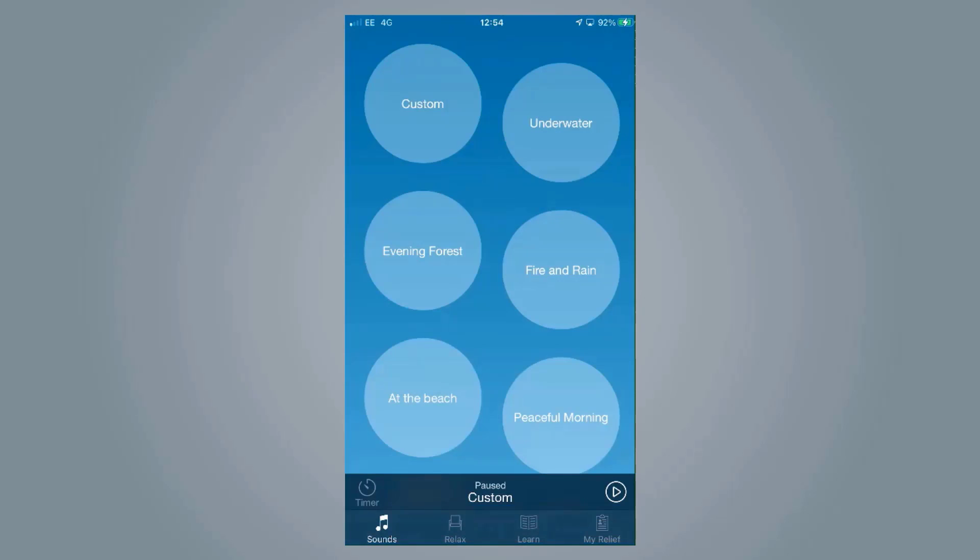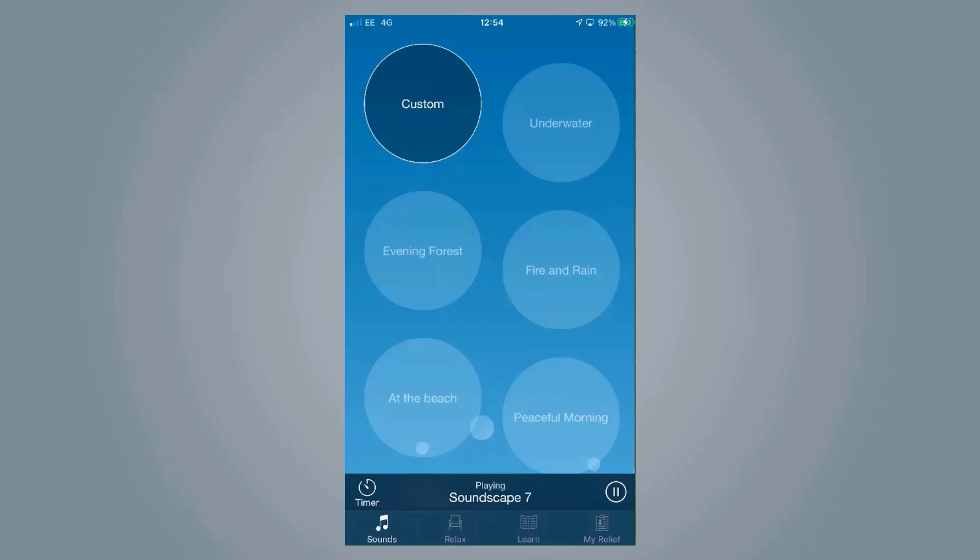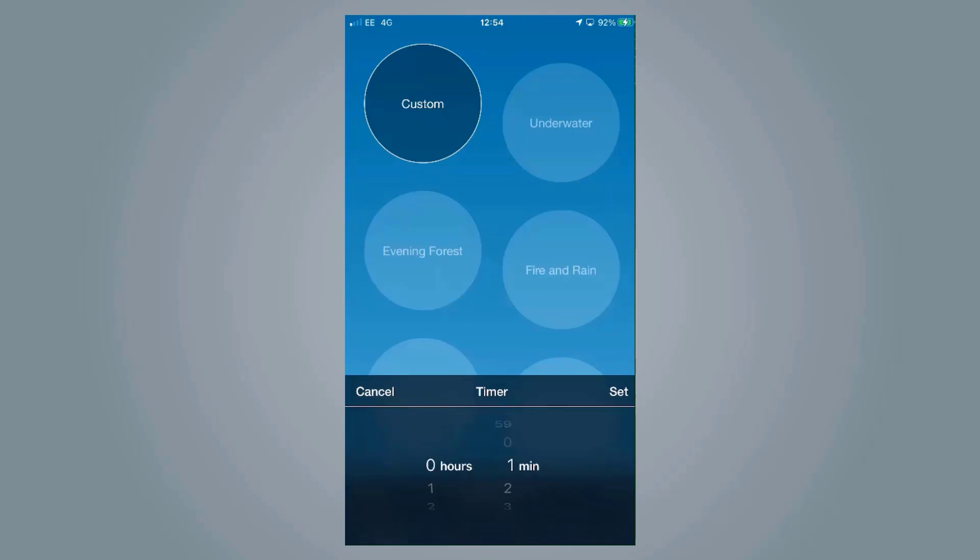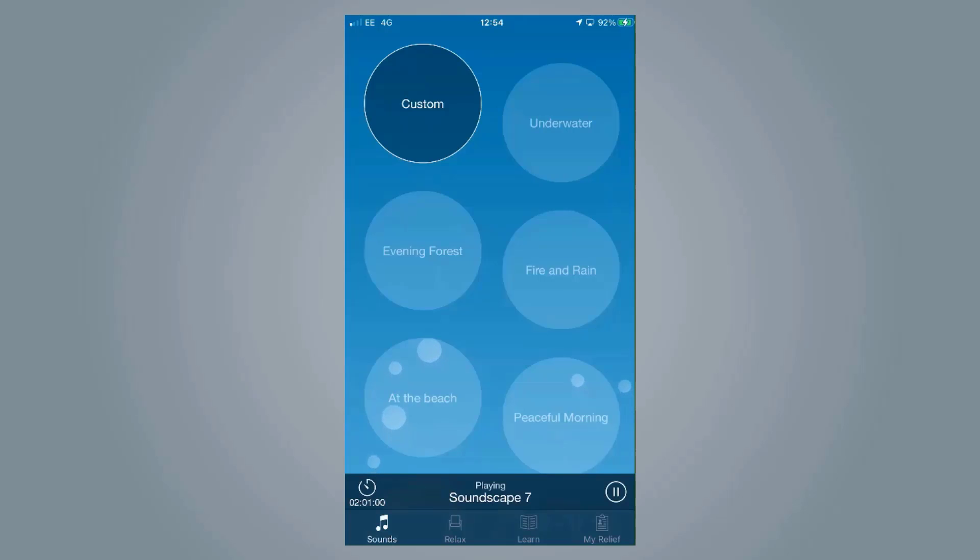What you can also do, once a setting is playing, you can set a timer for when you want it to stop. For example, if somebody needs this to help them get to sleep, they can simply press play, click timer, and set it to dismiss after two hours.